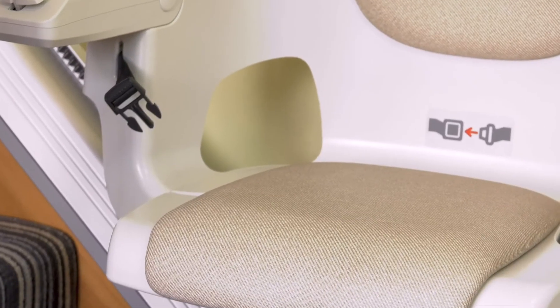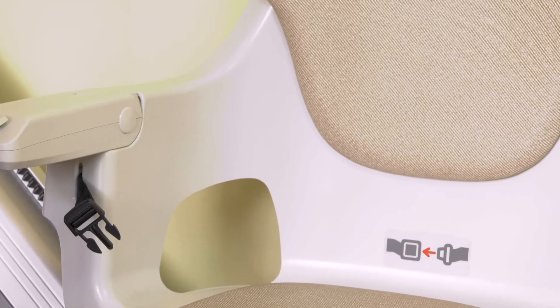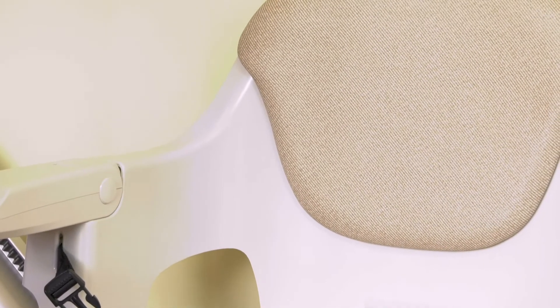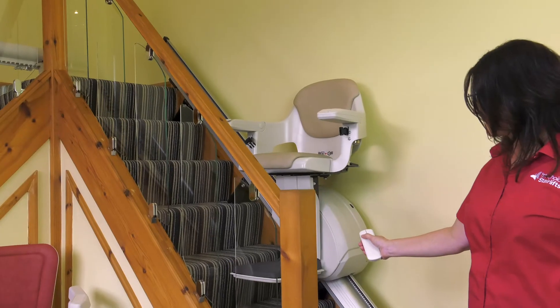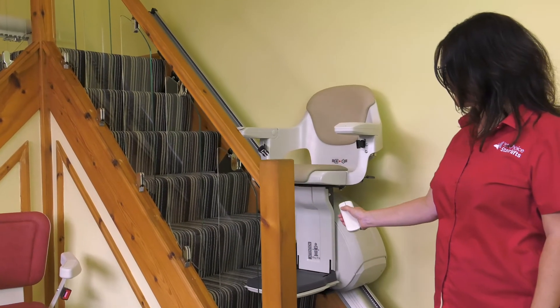The chair upholstery comes in a white clean vinyl in a neutral cream colour. The remote call send controls are used if two people in the house need to use the lift, or if you want to send the lift to another park position when not in use.